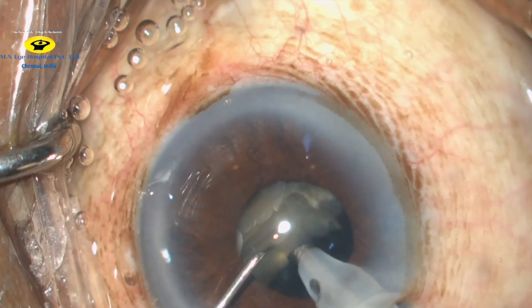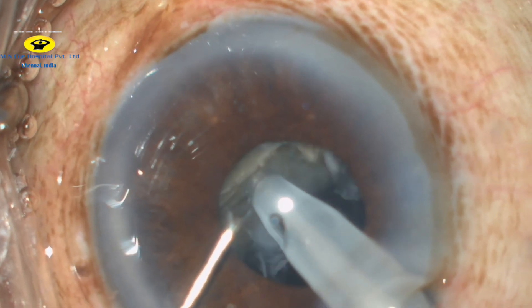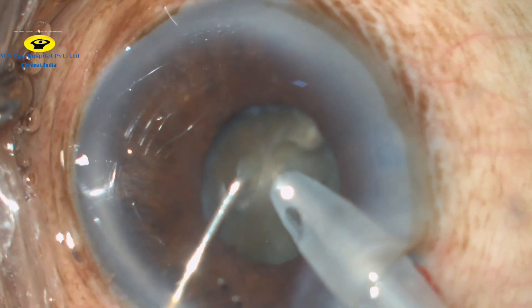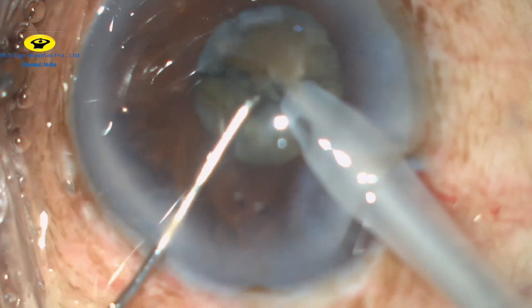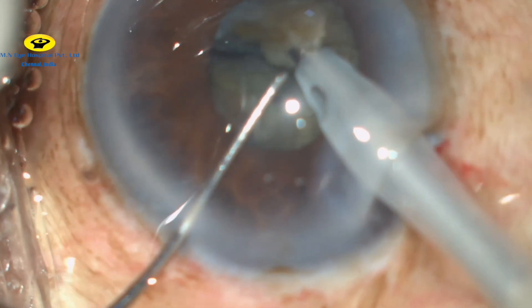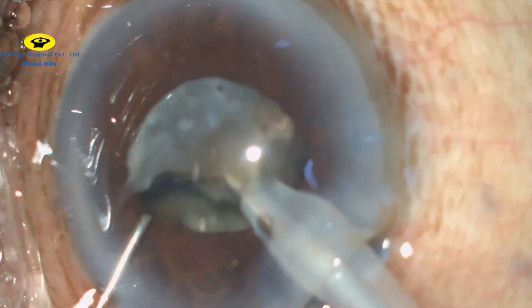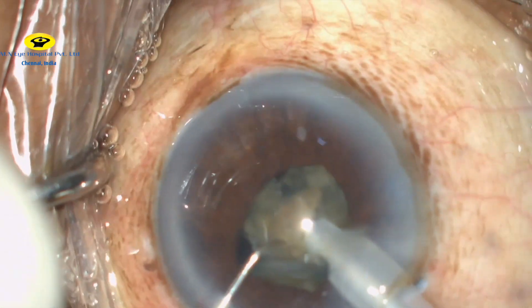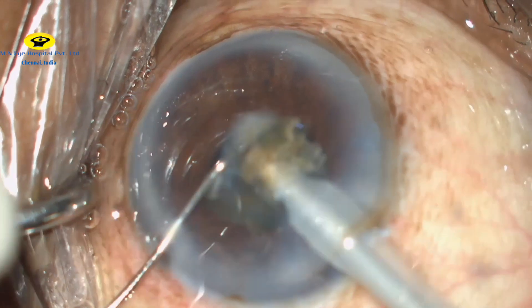The same process is again repeated by burying the phaco probe into the nucleus, slightly lifting it up, and then initiating the chop. The nuclear fragment is then brought to the pupillary plane and then gradually emulsified.